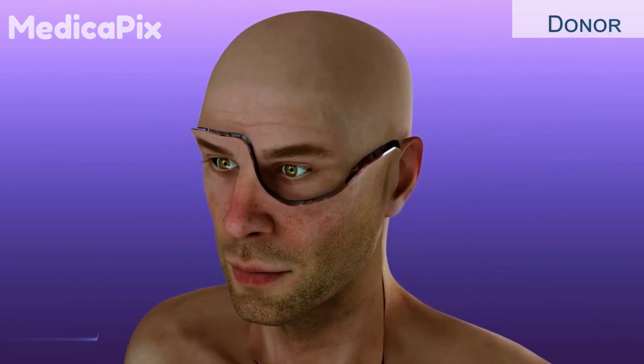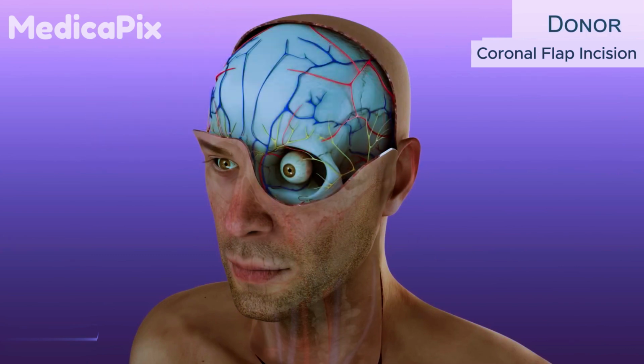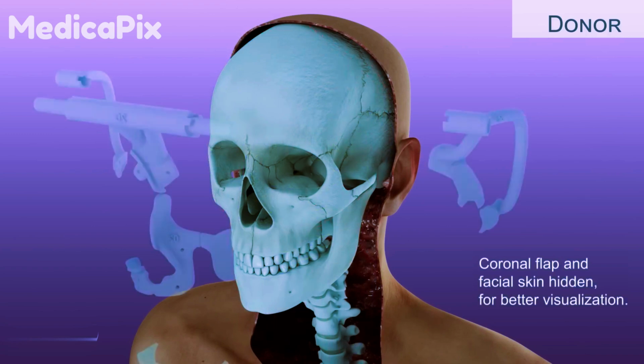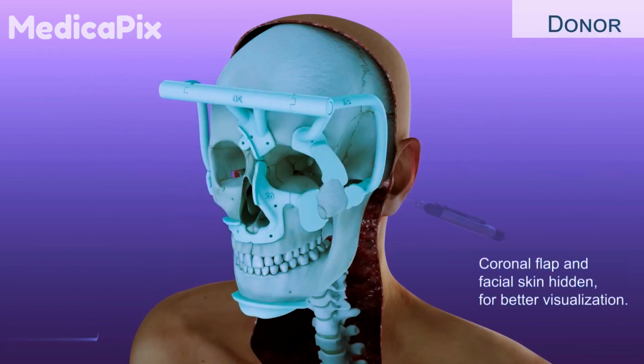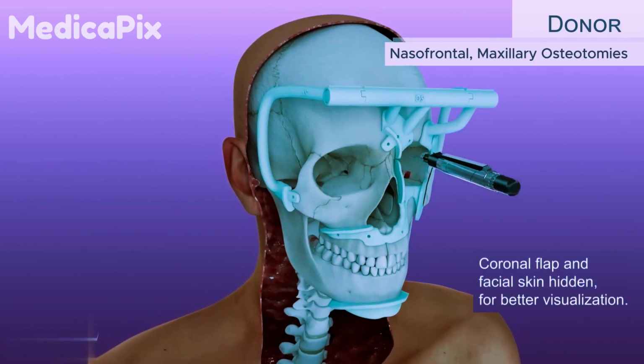and chin. The scalp and soft tissues of the forehead were then reflected forward, and dissection proceeded down to the periosseal layer. Prefabricated 3D printed patient-specific cutting guides were secured and used to guide the zygomatic, nasal frontal, and maxillary osteotomies.